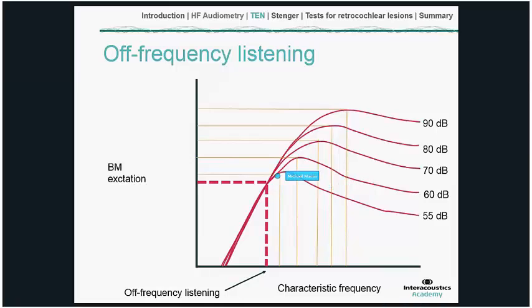So the envelope of activation for a middle frequency sound at, for example, 55 dB. If we were to increase the frequency of the sound as well as to increase the level of the sound a little bit, then we might end up with this second curve here, increase the frequency and the level again somewhat, and this third curve, and so on and so on.